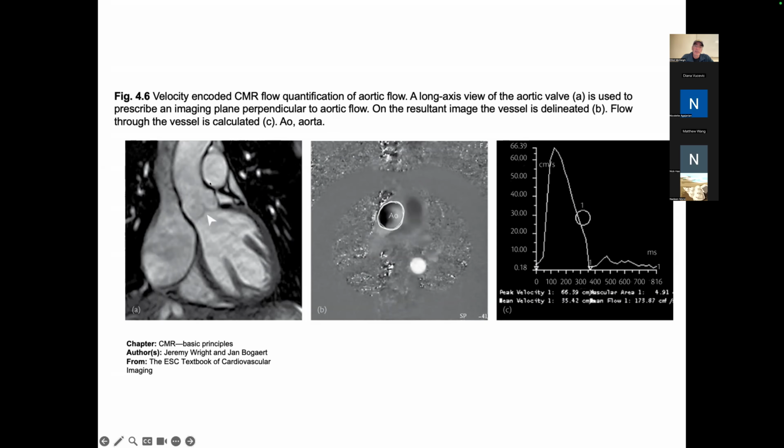So you can use this to very accurately measure things like the aortic flow. So if I put a slice along here, I'm going to draw it and I'll image my patient along this slice and plot the phase of the magnetization vectors coming out of the aorta. I can then integrate all of those velocities in here to get an amount of blood that is coming out.